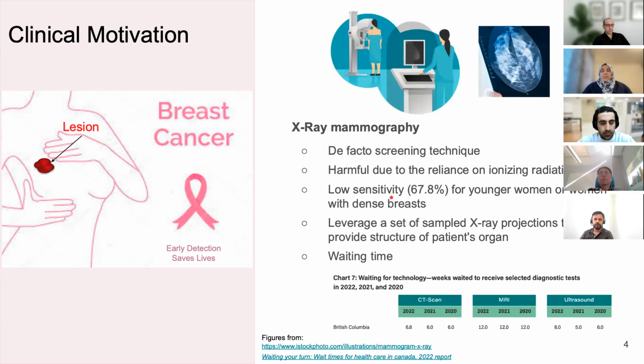X-ray mammography is the de facto screening technique. However, it comes with some harm, as it relies on ionizing radiation, and it has low sensitivity for young women or women with dense breasts. Additionally, the availability of mammography devices is often problematic, leading to long waiting times.